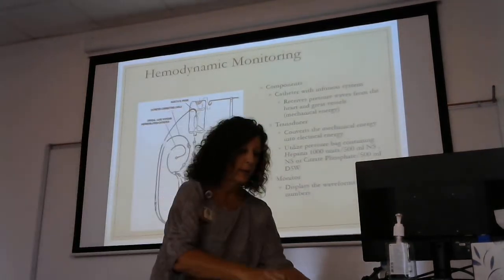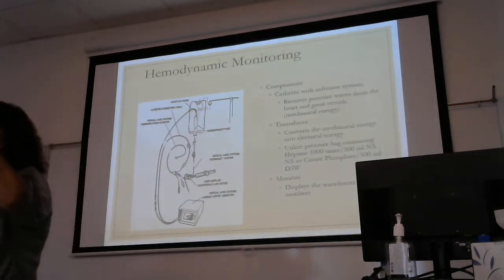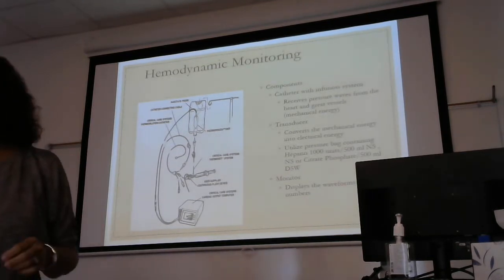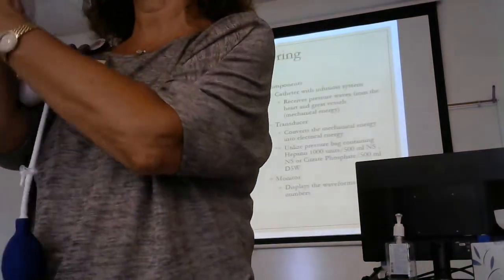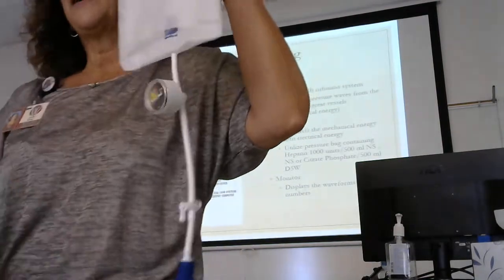Every hemodynamic assessment in your intensive care will have a pressure bag with it in order to produce a waveform on the monitor and give me that number, okay? This is a pressure bag. They give me all kinds of toys. These are disposable now, which makes them good for me because I get the toys afterwards. So you'll see the little sleeve here in the pressure bag. It's got a little hook at the top. They'll put a bag of fluid in here.